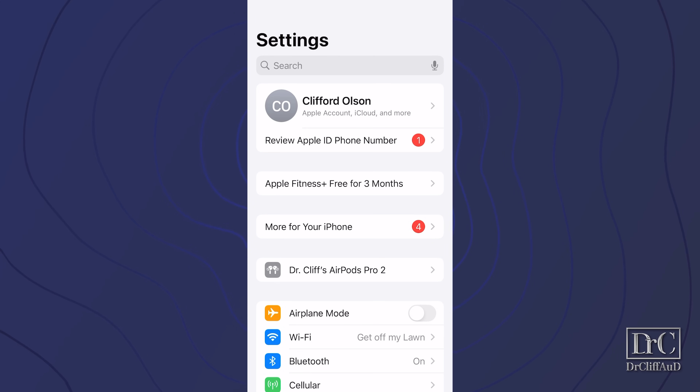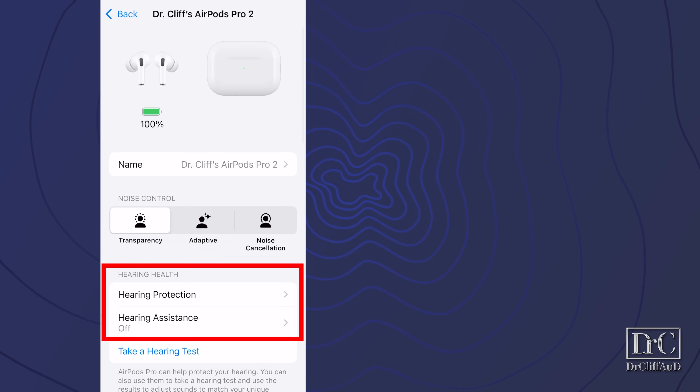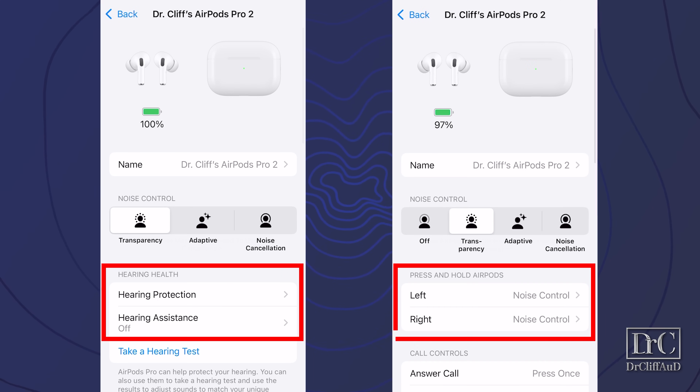Once you're updated, you can tap on your AirPods Pro 2 in the settings. If you see hearing protection and hearing assistance options under hearing health, then you are ready to start the setup process of your AirPods as hearing aids. However, if you do not see a hearing health section with these options, then your AirPods Pro 2 need to be updated.